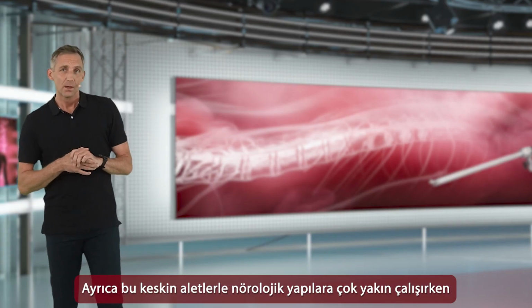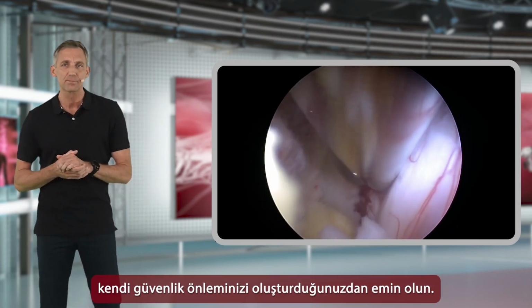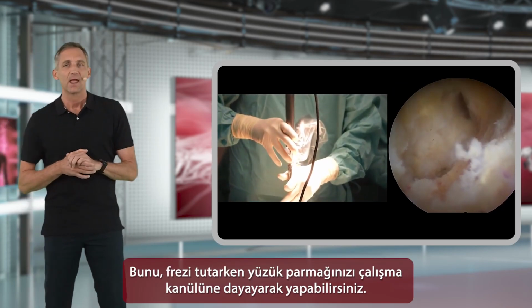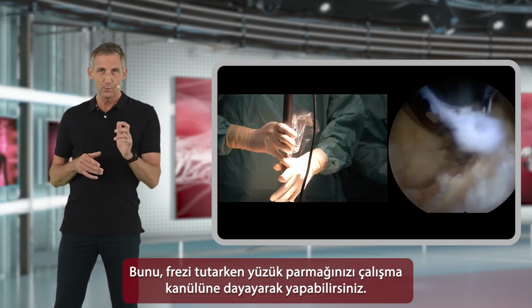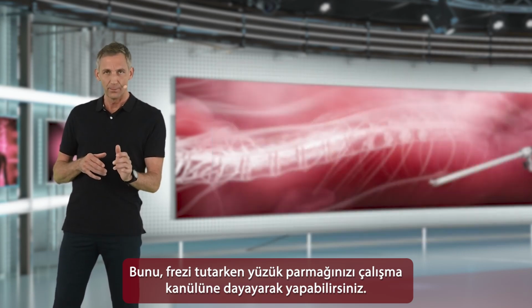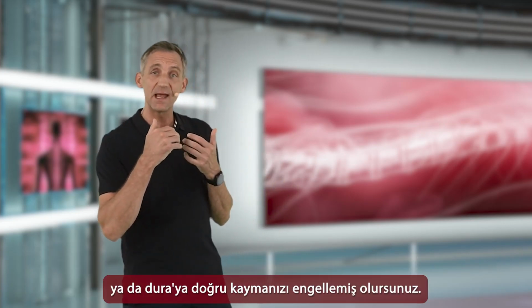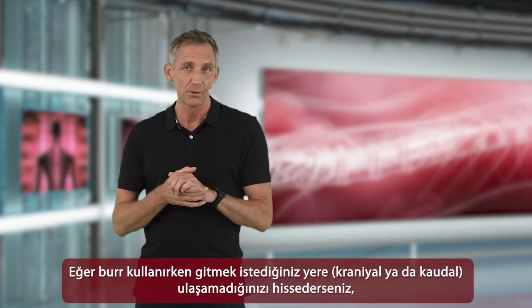Please also make sure when you are working with these sharp instruments in very close proximity to the neural structures that you basically build in your own safety stop. And you can do so by placing your ring finger, which is placed on the working sleeve whilst holding the burr. And by doing so, you will basically fix the plane in which you are working, and this will prevent that you accidentally slip down in the direction of the nerves or the dura.